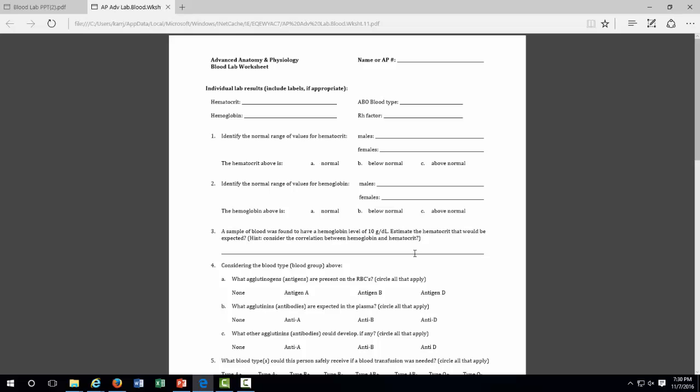So the hematocrit above is, oh, that would be if you tested yours. Yeah, so you can just say normal. The normal values for hemoglobin, for males is 14 to 18, and for females 12 to 16 grams per deciliter. Little d, big L. Grams per deciliter. And you can look at your hemoglobin, and if you're online, just say normal for now.